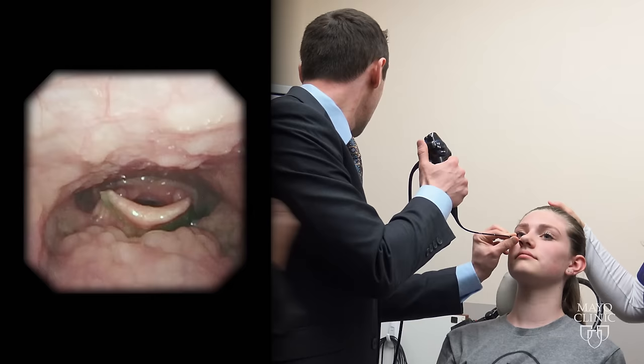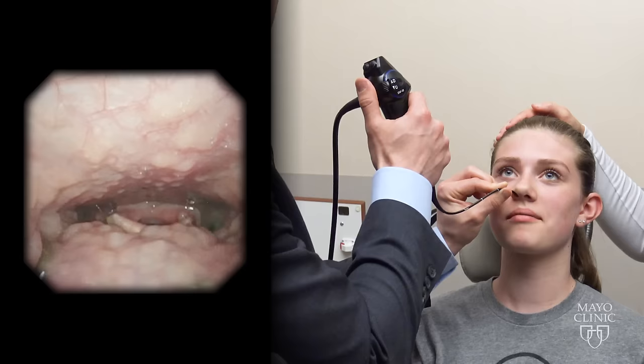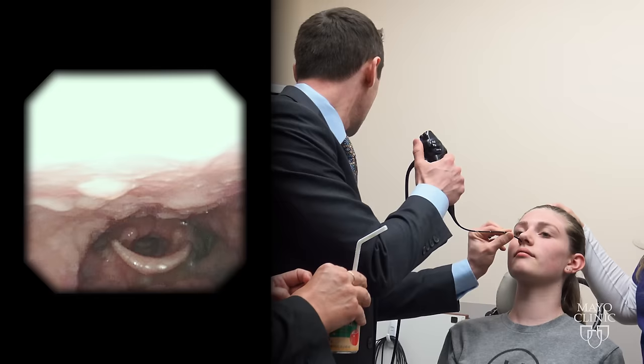Go ahead and take a bite of one of those. And one more. You can move your head a little bit. That's it. All done? I'm done.